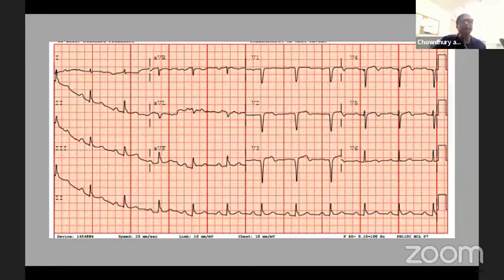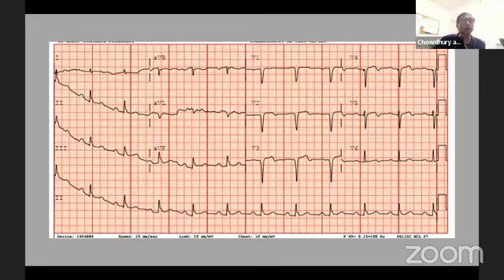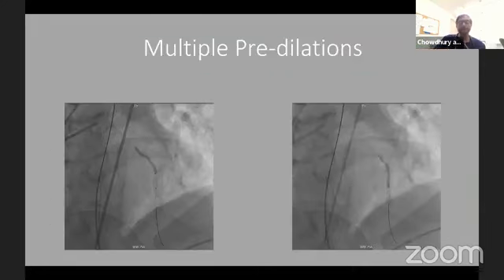And it is important to remember this EKG, because the patient goes home, 3 days later comes back to the emergency room with this EKG. We should be careful not to call a STEMI. It can be the tail end of the troponin, and it can be the previous EKG evolved into this. So old EKG and clinical context are also important.